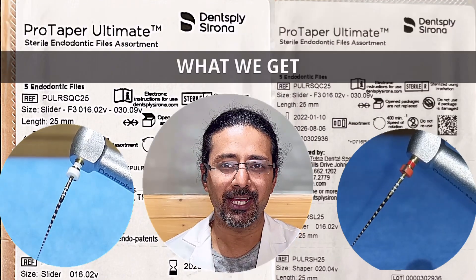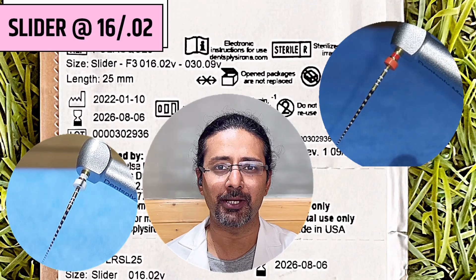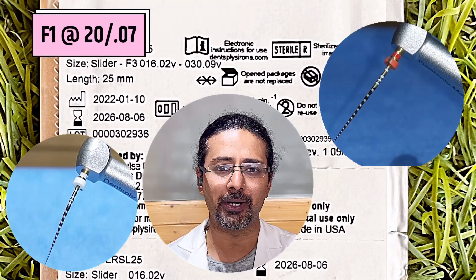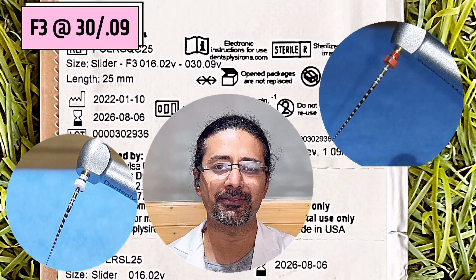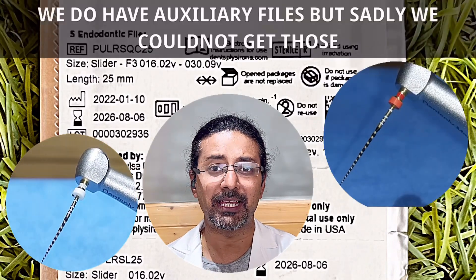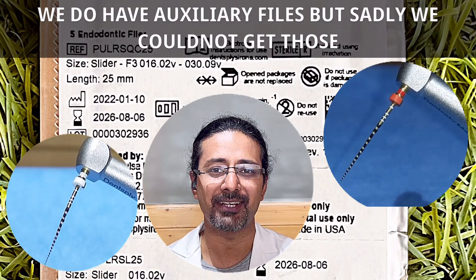Coming to the packaging, we have a Slider, we have a Shaper, and then of course the regular F1, F2, and F3. F2 is at 25/08 and the last finisher file F3 is at 30/09. We also get auxiliary Pro Taper Ultimate files, but sadly we did not receive those files.